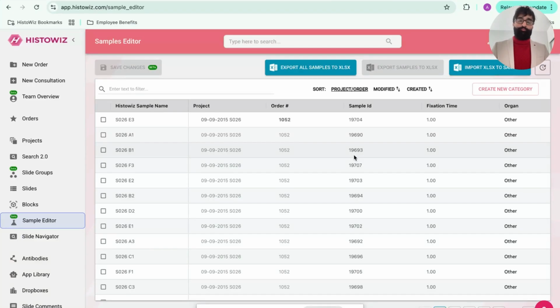So again, for example, if you're interested in some of the liver features from AIRA Matrix, such as percentage bile duct, percentage vacuolation, etc., you can run the AI app from AIRA Matrix and then add it as a metadata, and then that becomes a search field. So you can easily search through your liver tissues which exceed a certain threshold for bile duct or vacuolation.